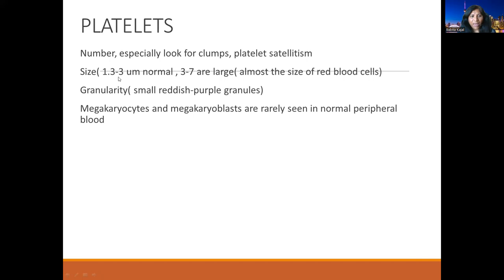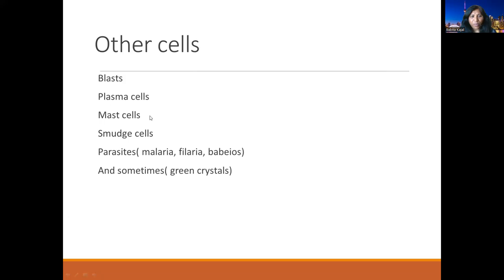The next component is platelets. Look at the number, any clumping, and size — 1.3 to 3 microns is normal, 3 to 7 microns is considered large. Look for granularity. Very rarely, megakaryocytes and megakaryoblasts can be seen. Other than these normal components, look for abnormal components that should not be seen in the blood film: blasts, plasma cells, mast cells, smudge cells, parasites, or organisms.